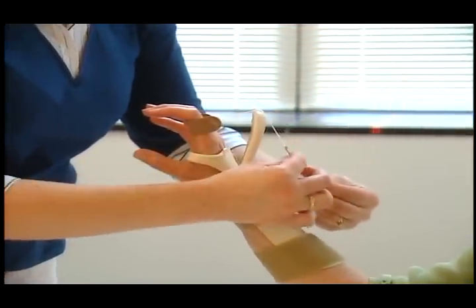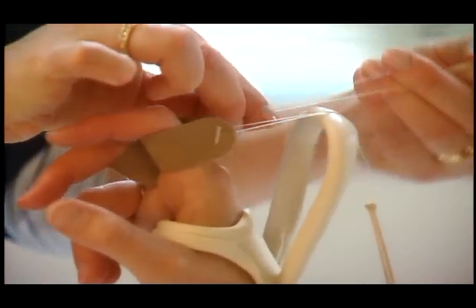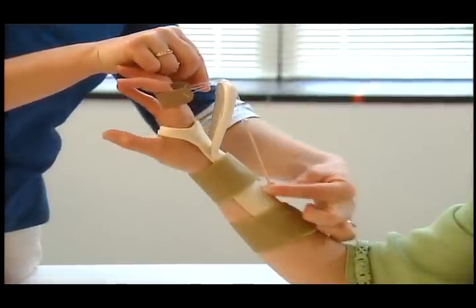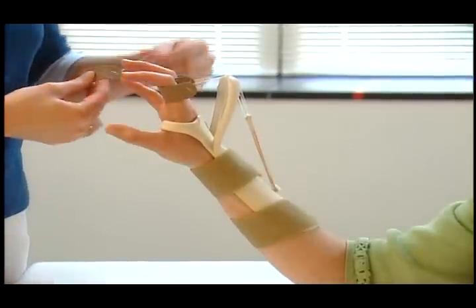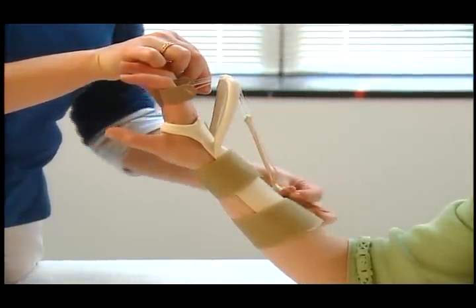It is critical to ensure a 90-degree angle of pull. This perpendicular force will prevent shearing stress and unwanted traction of the joint. It is important to remember that as mobility improves, the therapist must reevaluate and make changes to the outrigger to maintain the 90-degree angle of pull.